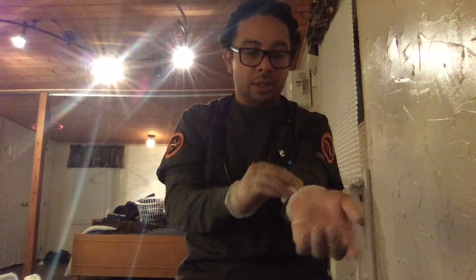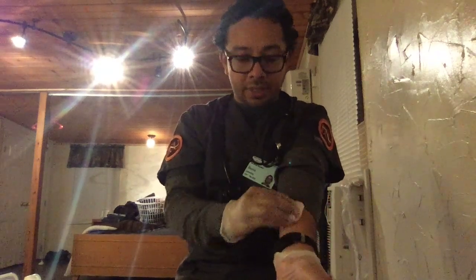So the first one I did was the intramuscular. The second one was the subq. This one is intradermal. So I clean the area where I'm gonna do my injection. Again, because it's the same one, I'll uncap it, same gauge and length. I would put it in at a 10-degree angle.